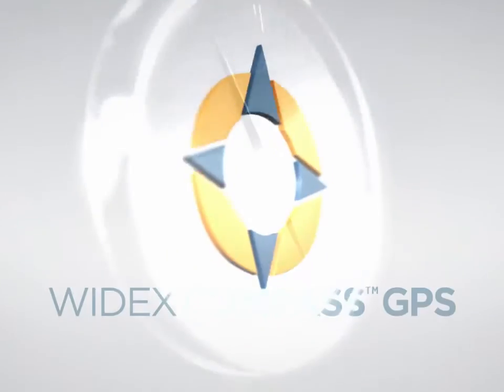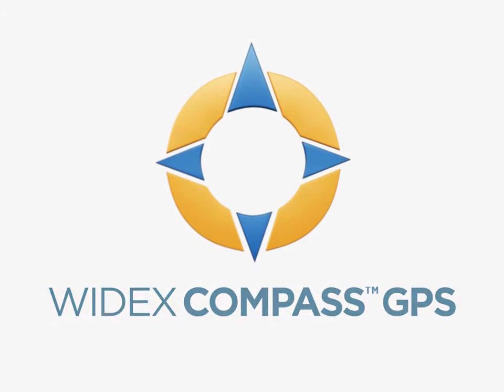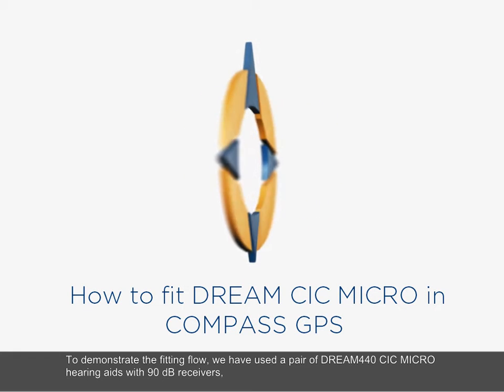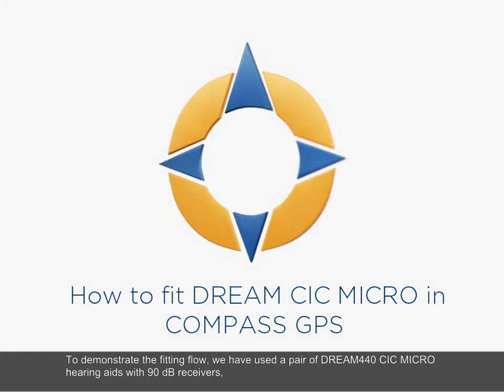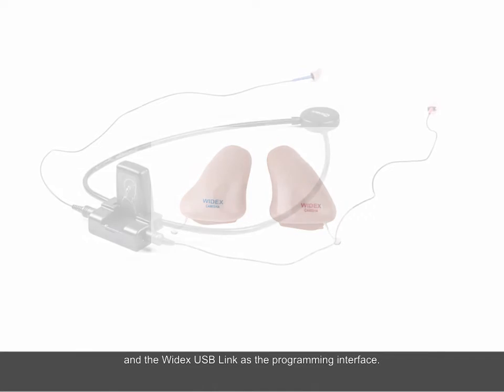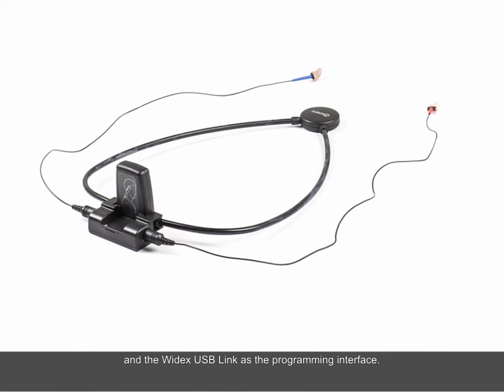Welcome to this e-learning tutorial on fitting Dream CIC Micro in Compass GPS. To demonstrate the fitting flow, we have used a pair of Dream 440 CIC Micro hearing aids with 90 dB receivers and the Widex USB Link as the programming interface.